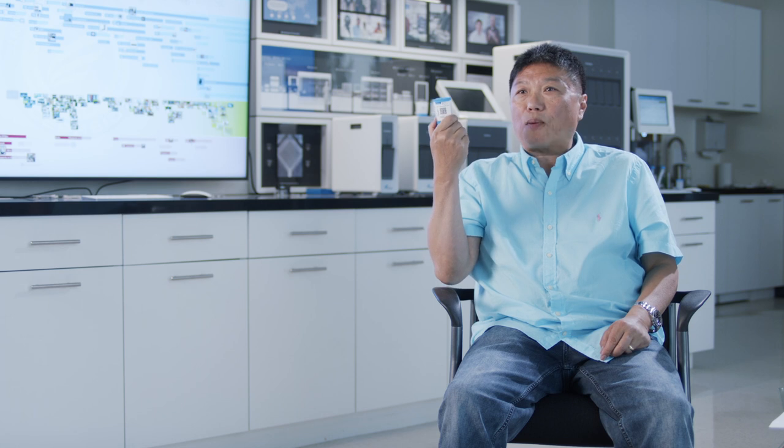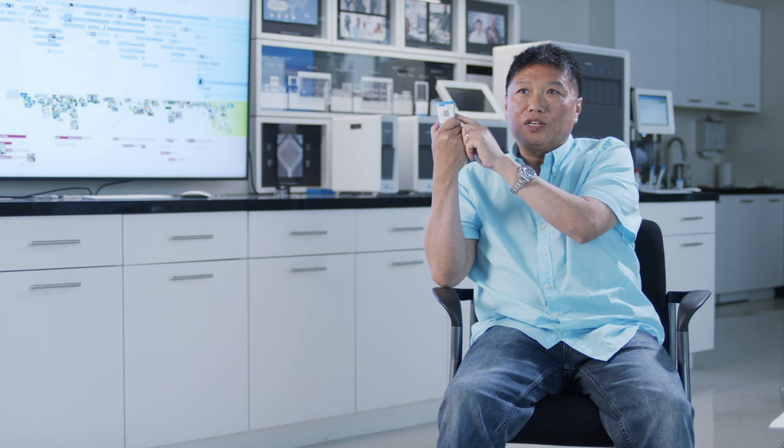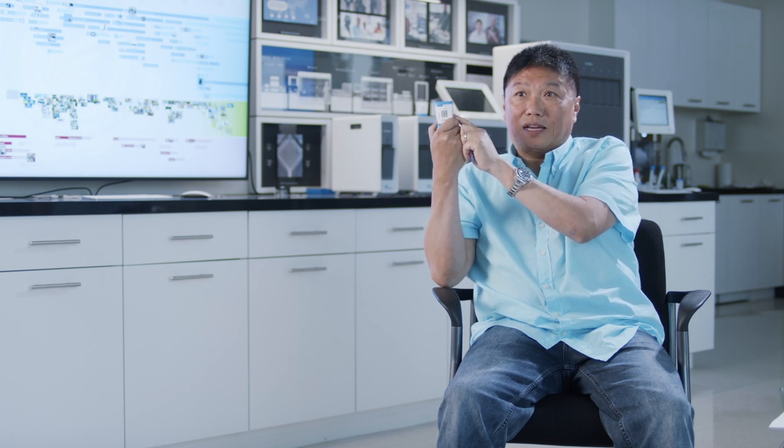We put ingredients. This is a programmable cartridge. Your blender — you want to make a margarita, you want to make a daiquiri, you want to make certain things. You put things in and mix them all up. So here we have a programmable cartridge, and depending on what you put inside, there are 11 chambers in there. We can program this cartridge to do multiple things.